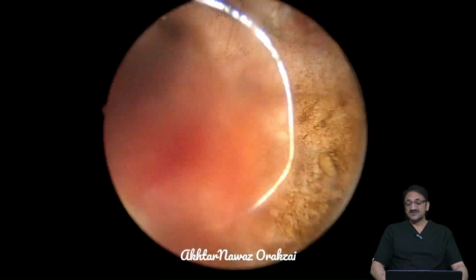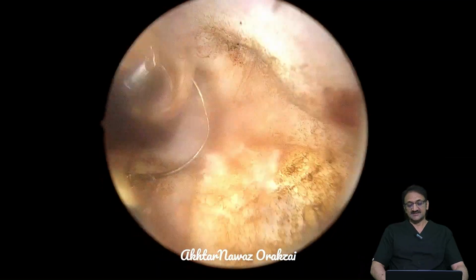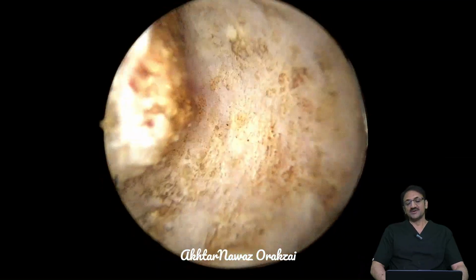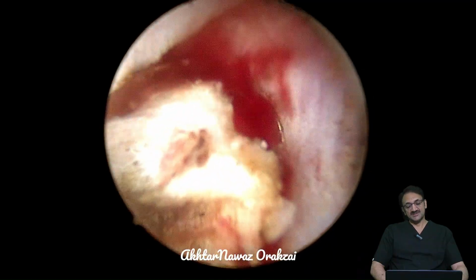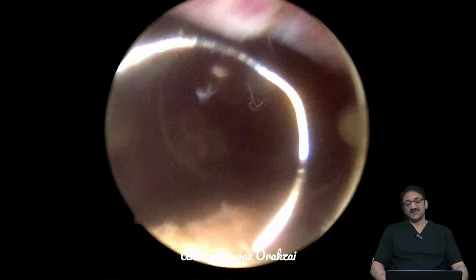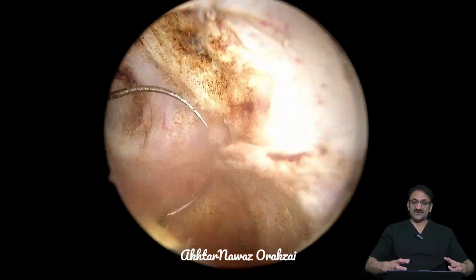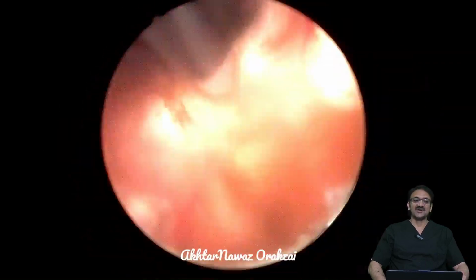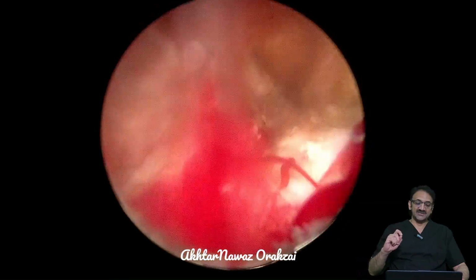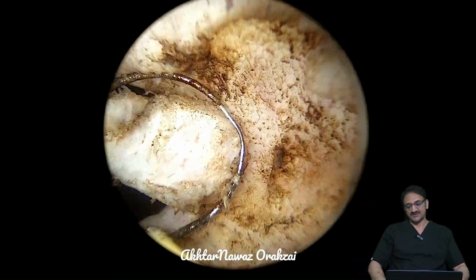The particular thing about this patient was that while we were performing the transurethral resection, since the stretch on the trigone was relieved after resection of the median lobe, a ureteric stone came into the intramural portion of the ureter.